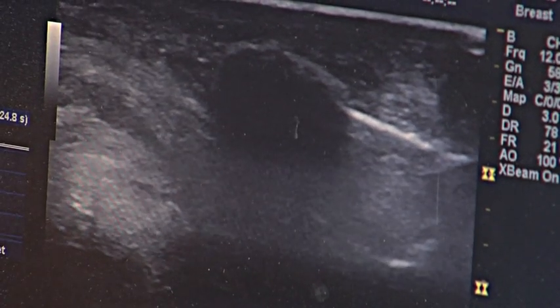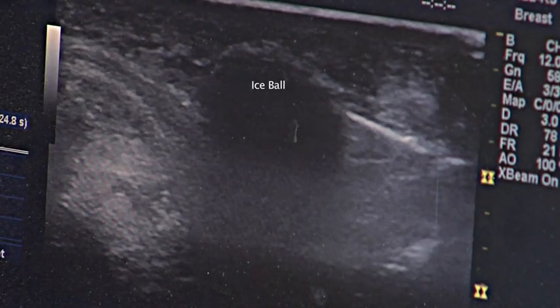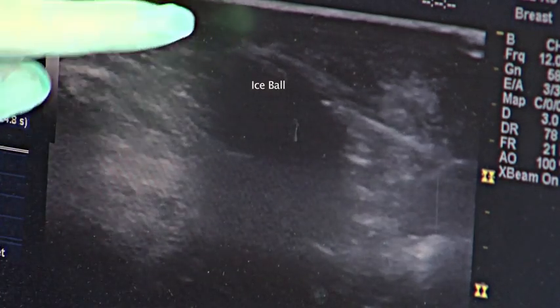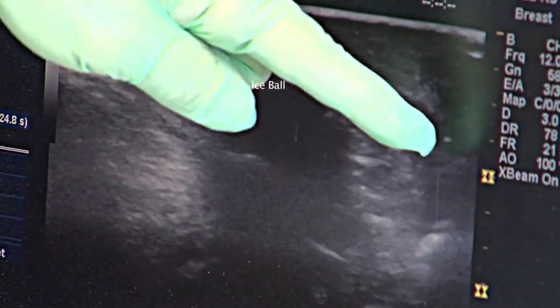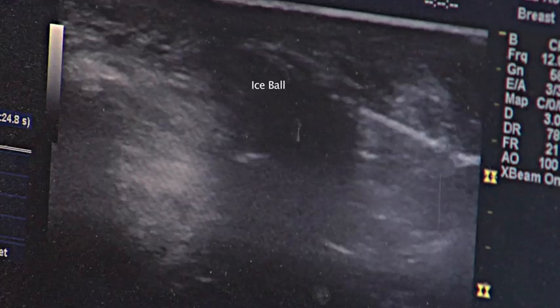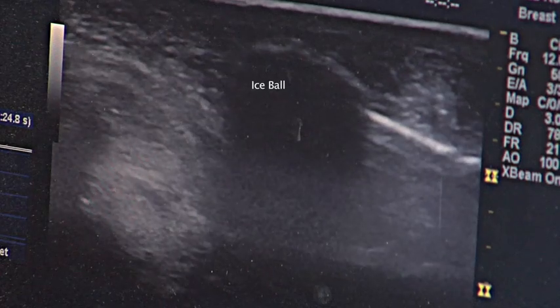There, okay. 1 minute. Now, get that picture, Dave. That is just beautiful. Bill's outlining for you the actual ice ball that's forming inside the foot on the nerve. You can see the probe and the ice ball. If I adjust the ultrasound just right there, it looks like a giant black Q-tip.